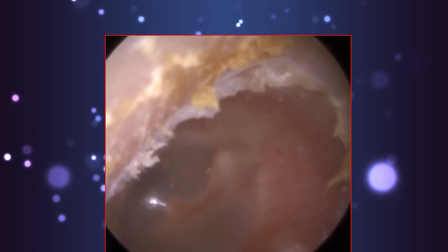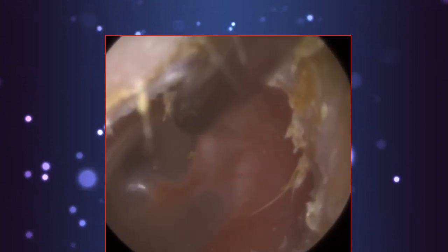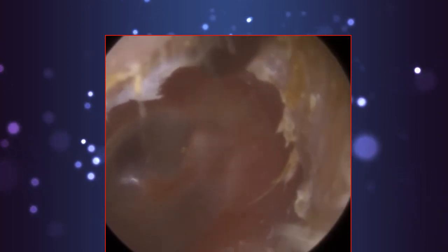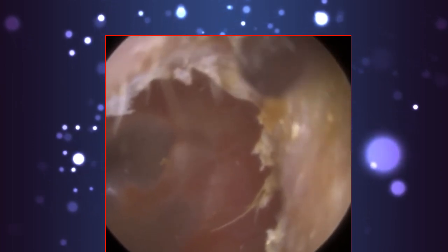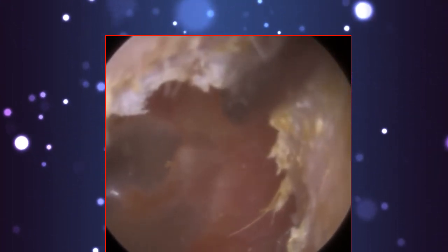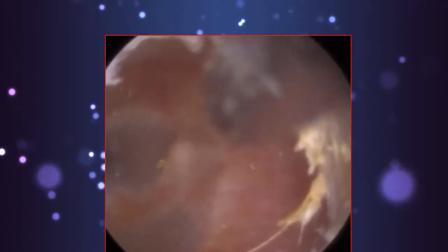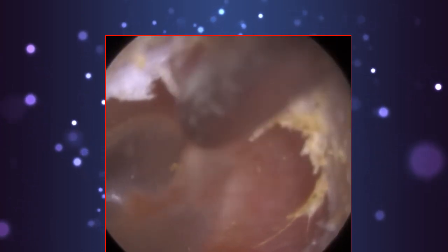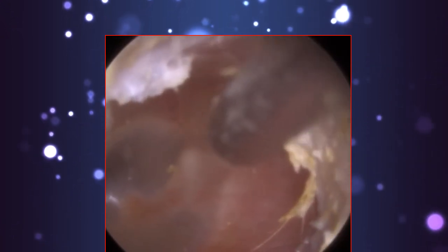When you've got a patient with a very narrow twisty ear like this, we just have to really stretch the ear open. So if we can straighten that first bend to make it in line with the second bend, it turns the ear canal into a straight cylindrical tube. Otherwise, the ear canal is like an S-bend. And if we've got two instruments in the ear, or even one instrument, if you've got the sucker, that's a straight instrument. It can make it difficult to navigate the bends of the ear. So by straightening the ear, you can use straight instruments and make the procedure much easier for yourself. So we're having to do that with this patient on both sides. The ear canal is very narrow, very bendy as well.